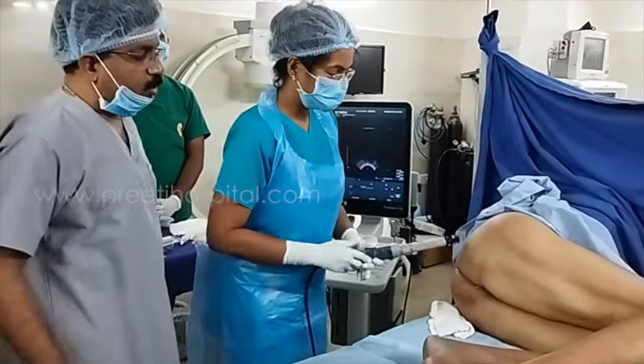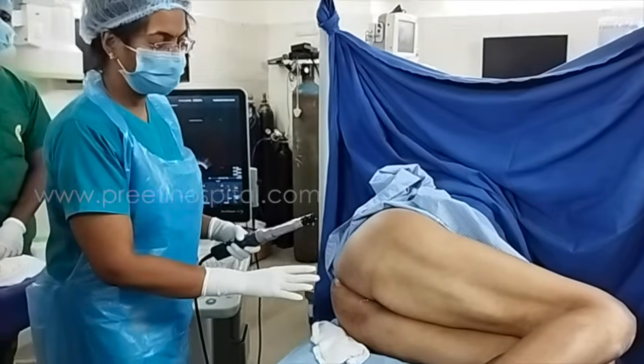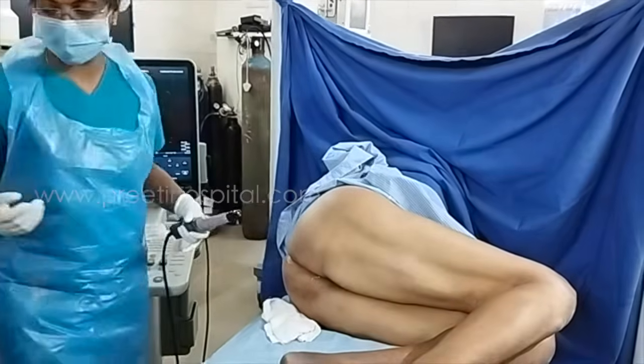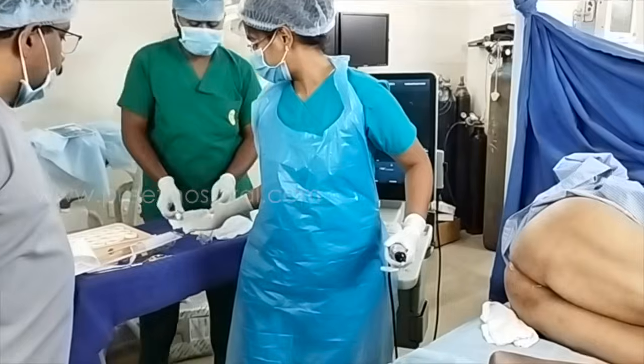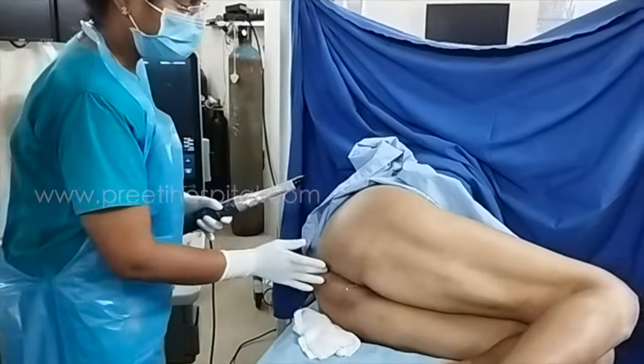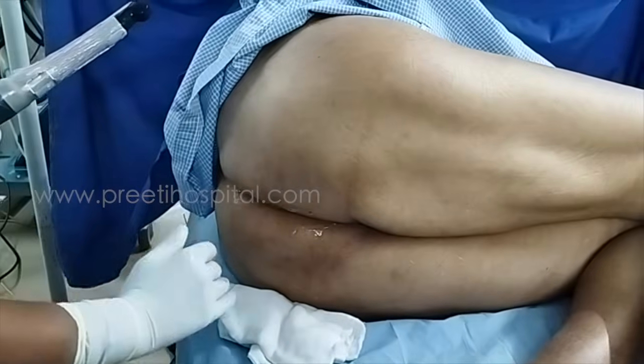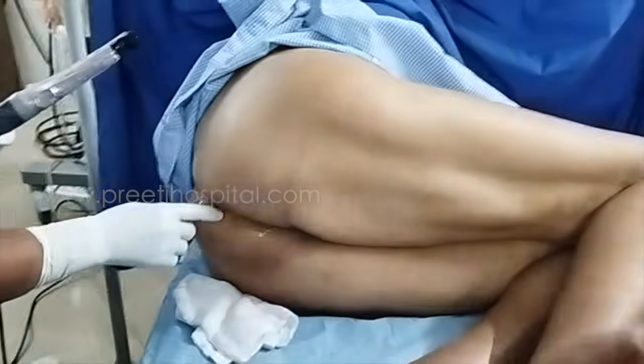Can you introduce it slowly? Initially, we do a digital rectal examination. We assess where the nodule is. Then, based on that, we use the probe. Some gel. Digital examination to see where the hardness is. Right side, left side? The top part of it is the right side, the bottom part is the left side. This is the anterior, this is the posterior.